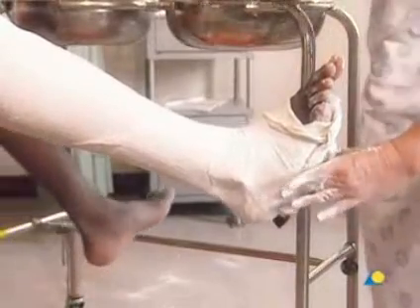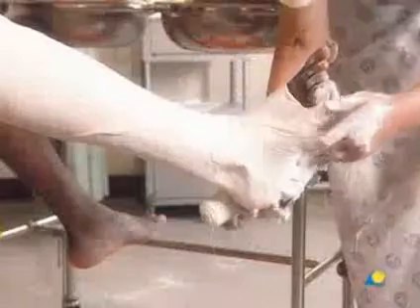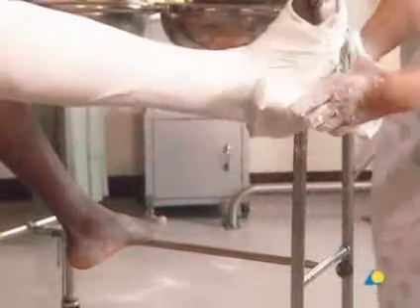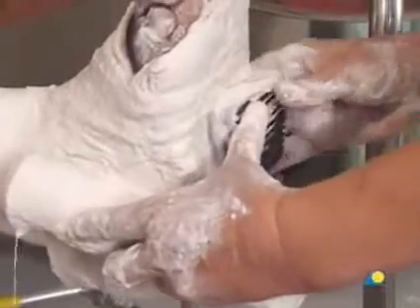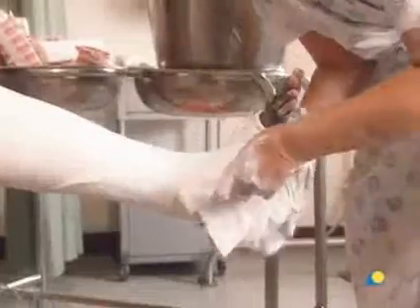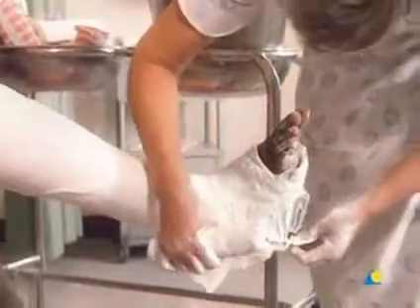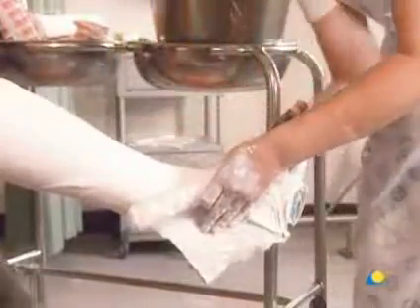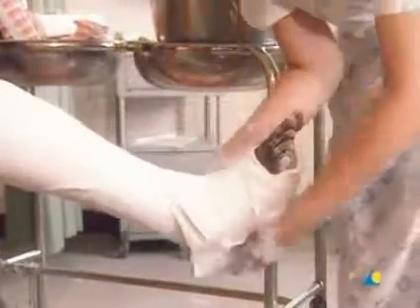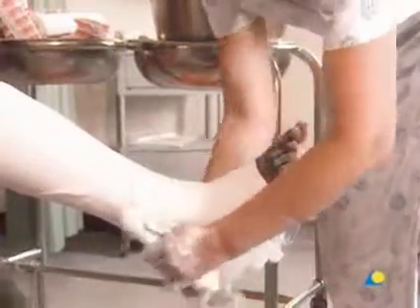The walking rubber is secured to the cast with a plaster bandage. Care is taken to ensure that the weight-bearing walking rubber lies perpendicular to the axis of the tibia and the back of the walking rubber is in line with it. This position will encourage the patient to walk with a rolling movement of the foot rather than by placing the weight on either the heel or toes.